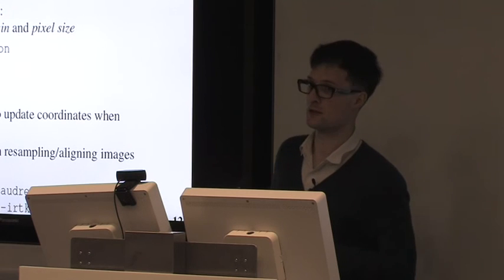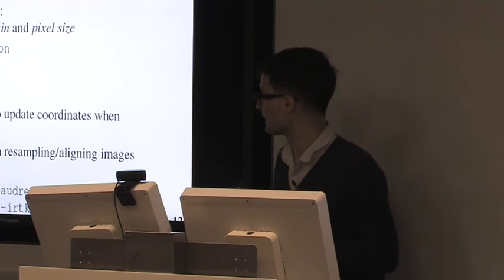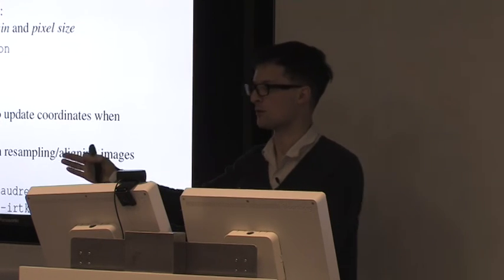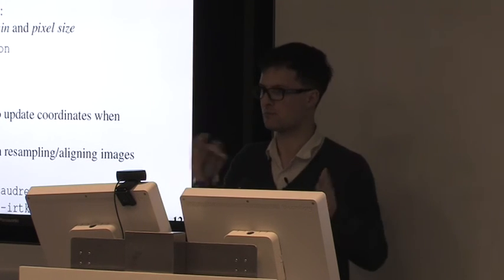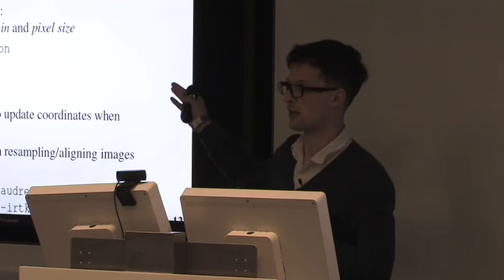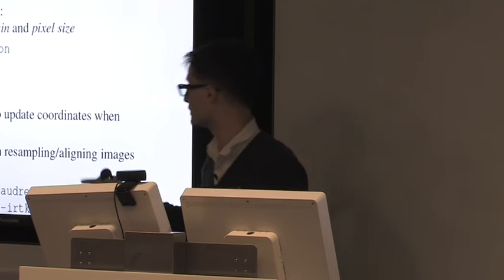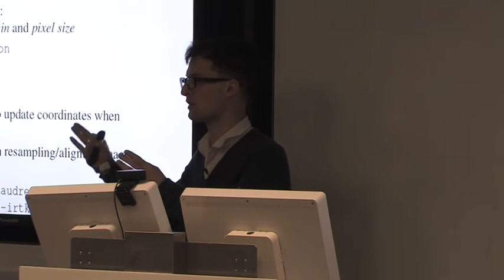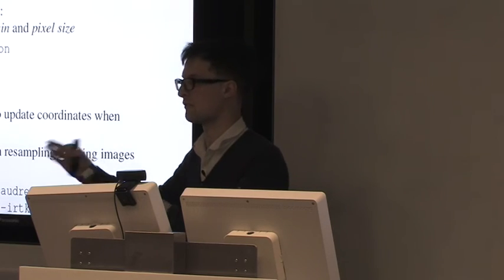The benefit of doing this wrapping myself is that, compared to, let's say, a SWIG interface where C++ objects are automatically mapped to some Python stuff, having a subclass of a NumPy array means I can overload getitem, so that whenever I crop an image, the spatial coordinates are updated. Whenever I slice it, same thing.